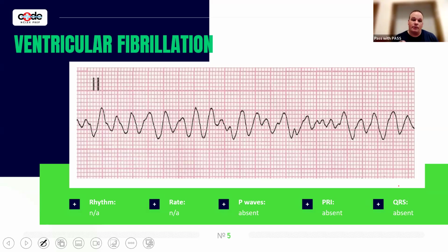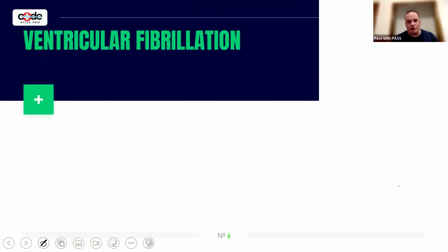Okay. Now, from a cardiac arrest perspective, hopefully we can see a ventricular fibrillation or a pulseless VTAC rhythm on the monitor, because those are both rhythms that we can defibrillate. And we're going to talk about that a little bit more in a few minutes. But if the patient is in cardiac arrest, VFib or VTAC is really what we want them to be in, because those rhythms can be defibrillated, which gives the patient the best chance of actually getting back into a normal, organized rhythm that can hopefully sustain life. So this is ventricular fibrillation, or one version of it.